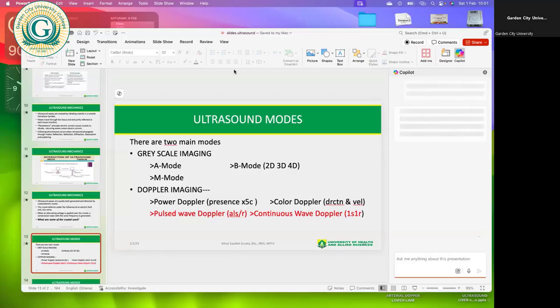Your liver would be more compact or more dense in terms of its tissue than your urinary bladder. So with that thinking, when the sound waves interact with these two structures, your liver, which is more dense, would appear a bit brighter than your urinary bladder, which is less dense. Are we following?